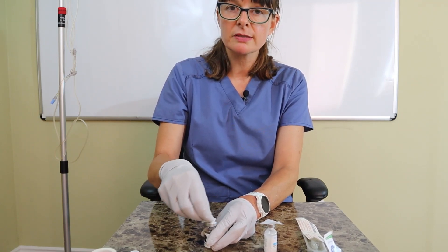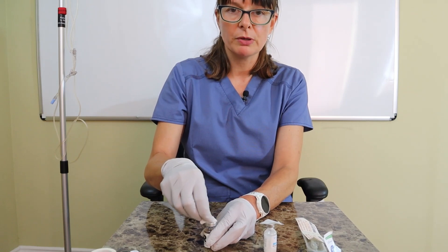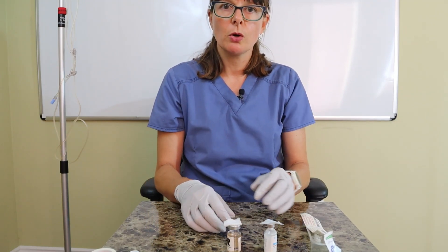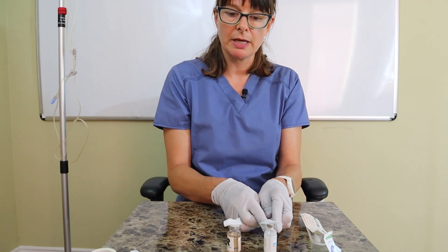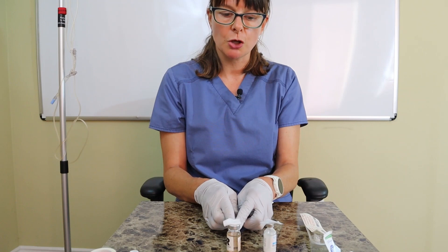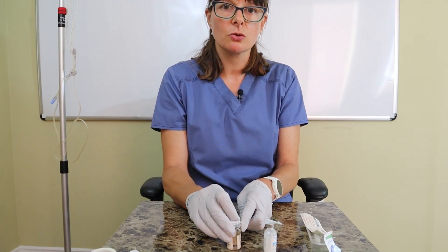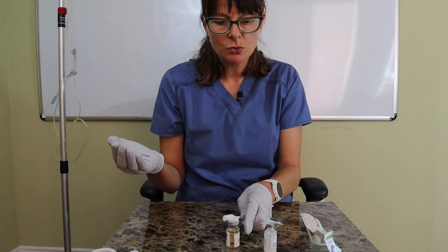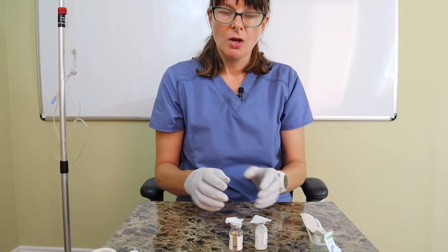The tricky part here: we want to mix the insulins in the syringe only, not in the vial. Because we always have to insert air into any vial before withdrawing medication, there is a certain order we must follow. It is less harmful if regular insulin gets into the NPH, because regular insulin's onset, peak, and duration are shorter. However, if NPH gets into the regular insulin vial, the regular insulin will last much longer than expected, which could make the patient hypoglycemic.